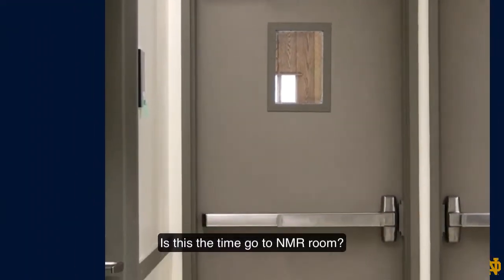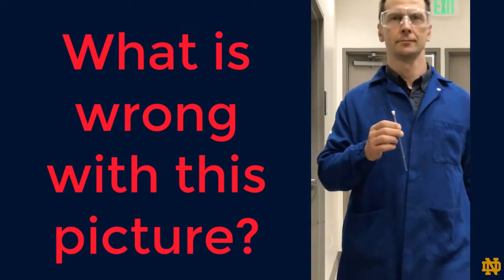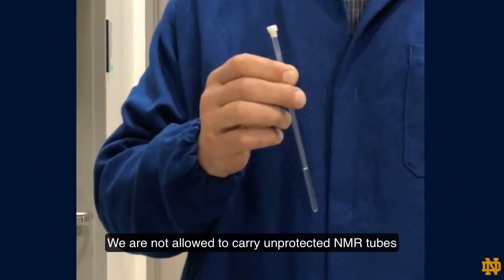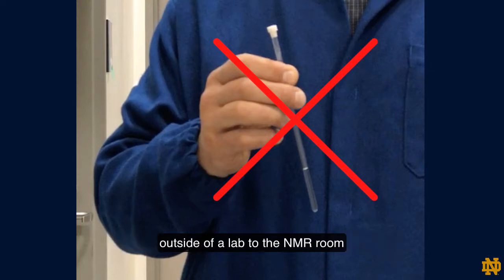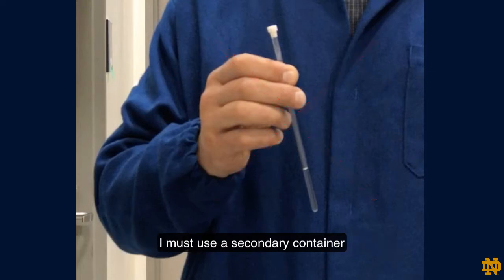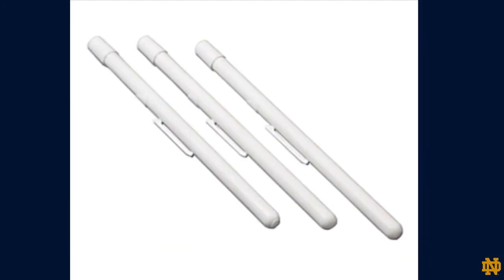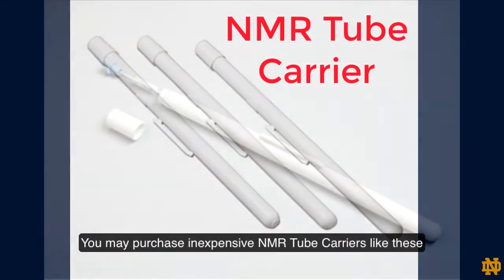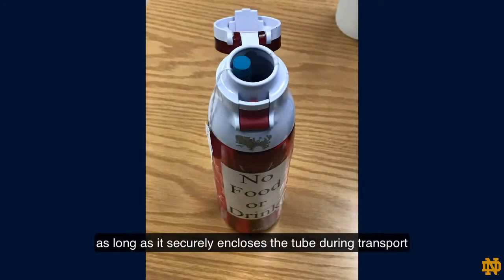Is this the time to go to the NMR room? Not quite yet. We are not allowed to carry unprotected NMR tubes outside of a lab to the NMR room. I must use a secondary container to prevent the tube from breaking and spilling a sample if it is dropped on the floor.